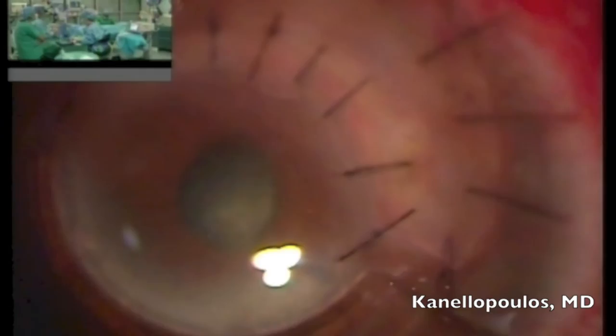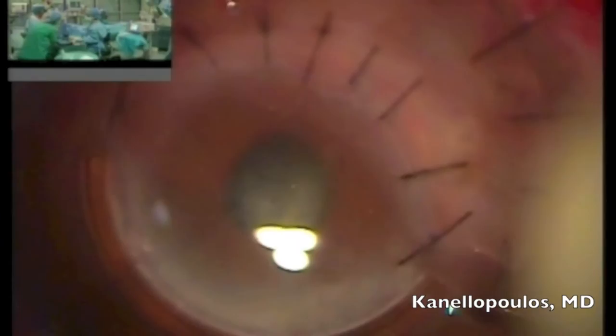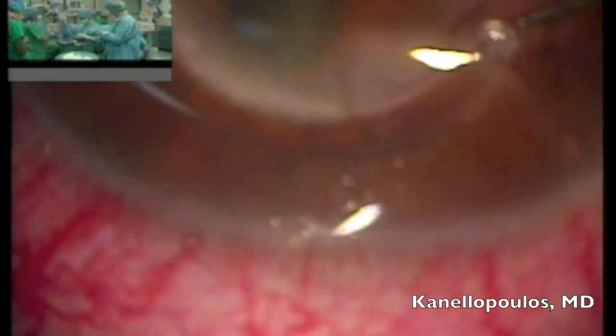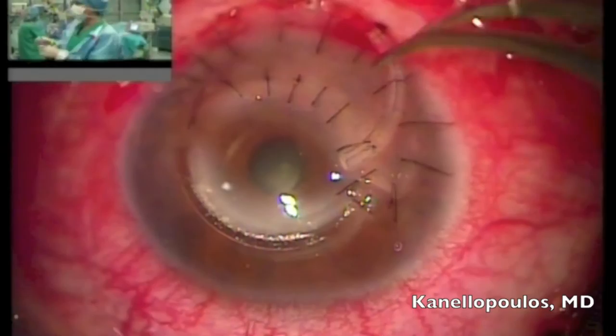We will now create an incision right next to the superior INTAC. It will be removed at this point. A 15-degree blade is used to enter near the INTAC. A reverse Sinskey hook is placed to enter the little hole that the intracorneal ring segment has and then deliver the ring segment outside the cornea. The reason we're removing this is to avoid any future complication in this eye from the upper INTAC.